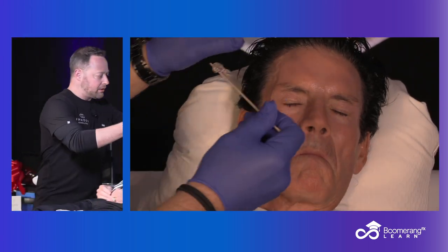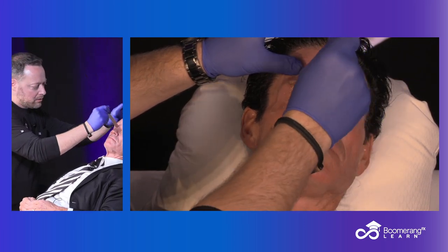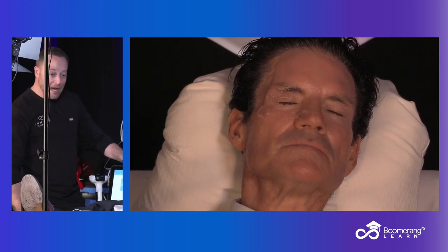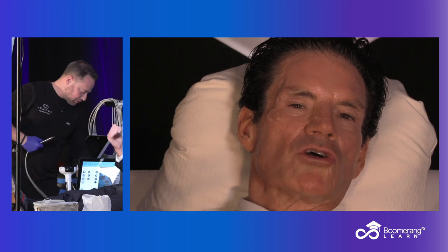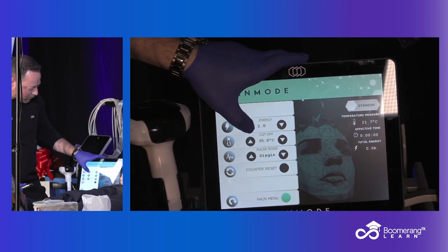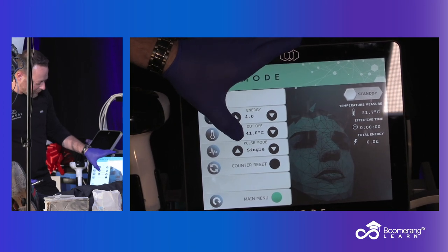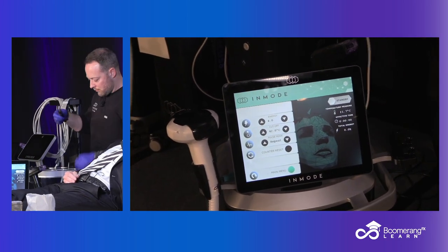I'll go over settings on the screen. Dr. Mulholland is going to keep his eye closed essentially. We'll apply clear ultrasound gel in the area to be treated. We've got the Forma Eye hooked up, and we'll select it on the screen. Settings are very similar: RF power and a cutoff temperature. A good starting protocol is usually four to five on energy — I like to start right about four. Cutoff temperature: 42 degrees Celsius, 43 if it's comfortable — that's always going to be the max. Better to go low energy and sneak up on 43 over a minute than high energy, get there in 30 seconds, and cause discomfort — then you lose the patient's confidence. Around the eye, that's not a good thing.